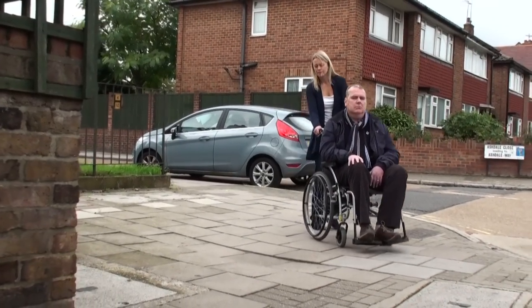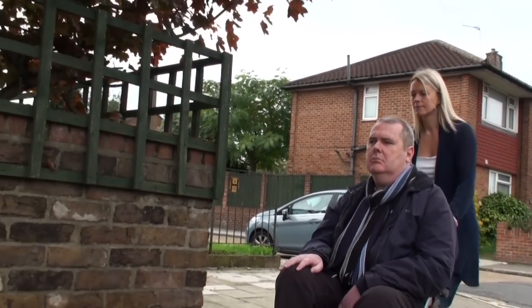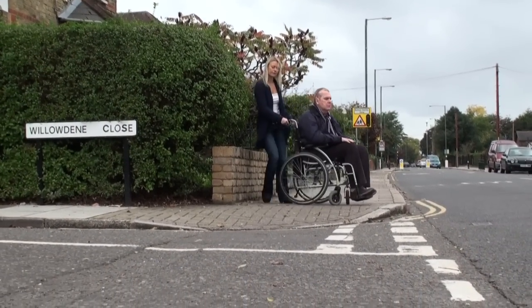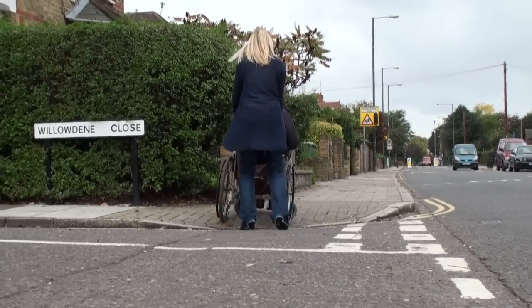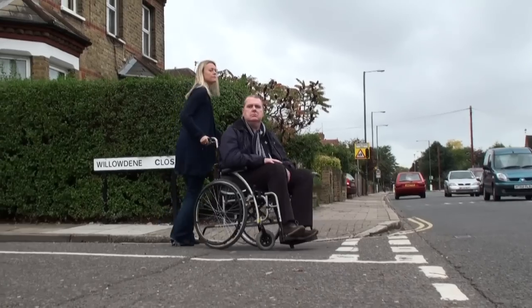When outside, be aware of bumps and potholes. Also be aware of other people on the pavement. Be aware some dropped kerbs can be more awkward. If this is the case, reverse the wheelchair, allowing the larger back wheels to manoeuvre more easily over the kerb.